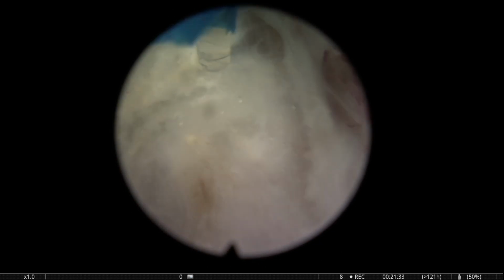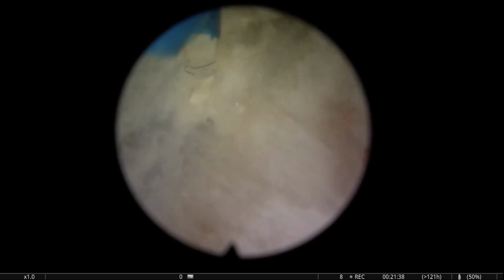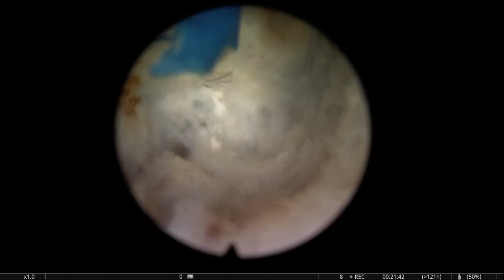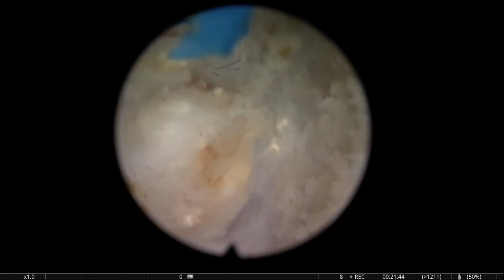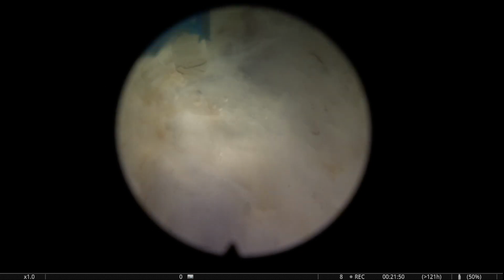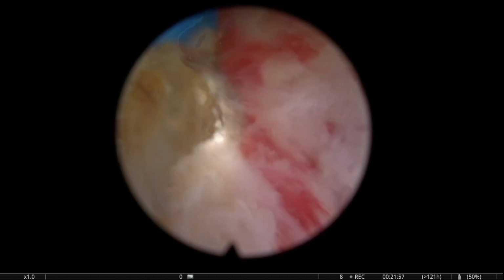These nodules usually grow into the capsule, and they make the capsule much thinner. So that's why some people are a little bit afraid of removing them. You see the nodule? So in these cases, you have to use your knowledge of the basic way to use the fiber, to use the energy.